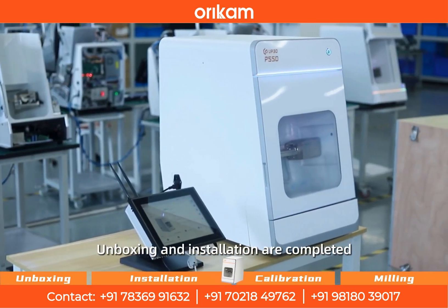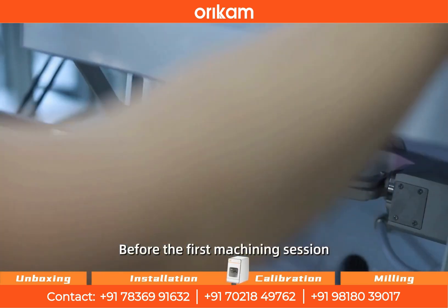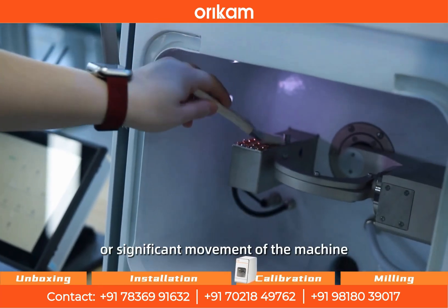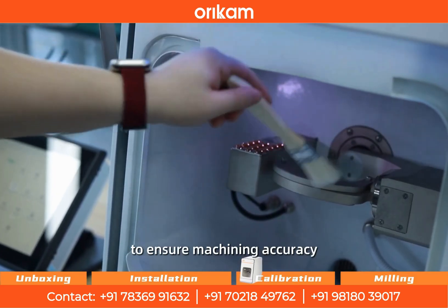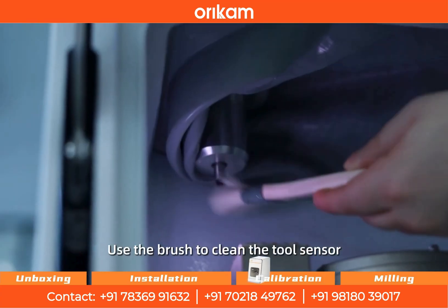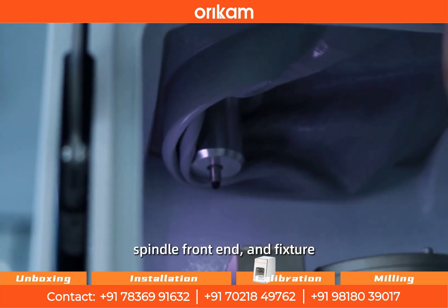Unboxing and installation are completed. Before the first machining session, long-term machining, abnormal machining, long-term shutdown over two weeks, or significant movement of the machine, automatic calibration is required to ensure machining accuracy. First, find the brush in the accessory box and use it to clean the tool sensor, tool holder surface, spindle front end, and fixture.